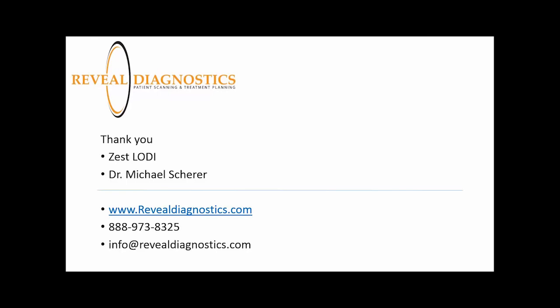If you're in the San Francisco Bay Area, I would encourage you to send patients to us, and that way we can facilitate that entire process from pre-scanning considerations to actually doing the scan, doing the denture scan, lining it with Green-Mousse, and doing all of the software, uploading to Anatomage and treatment planning for you. So really all you need to say to us is, here's a patient with a denture and a stone model. Help me create that guide.